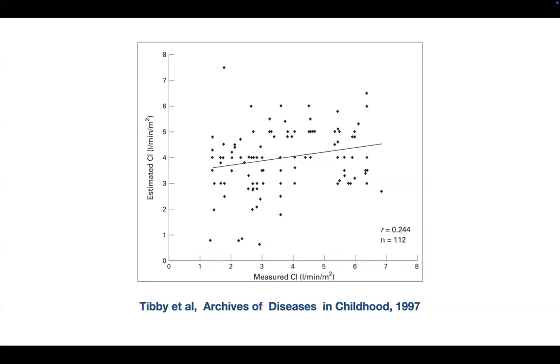And for the statisticians in the crowd, this is essentially just a coin flip. And really, people had no idea. And it didn't matter how experienced you were, which I find very sobering, that we don't really have a sense. Cap refill, all of that, we cannot guess the cardiac index based on our clinical exam. So that's where ultrasound has been heralded as a tool.